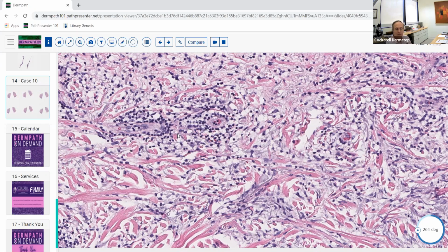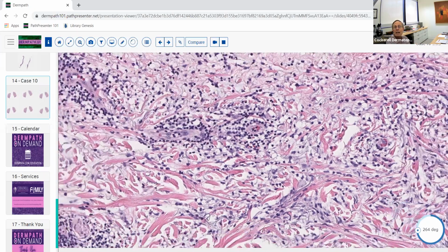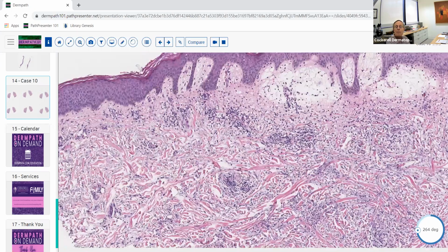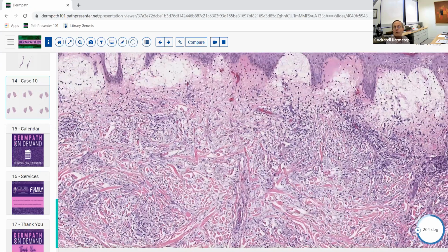And it looks like this. Lymphocytes are really around and inside the endothelial cells of the blood vessels. And it's one of the few conditions where you really and truly do get a lymphocytic vasculitis. You can get neutrophils in the infiltrate also, they come in secondarily, but the main cell that goes after these rickettsiae is a lymphocyte. And you can get this pattern that you see, this sort of lymphocytic vasculitis with papillodermal edema in some cases. And that's characteristic of these rickettsial dermatoses.